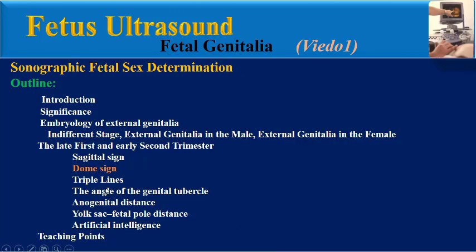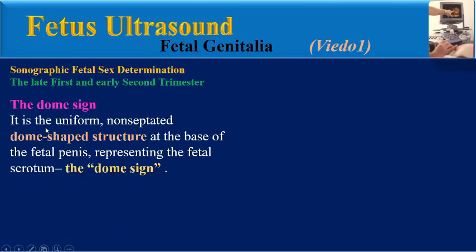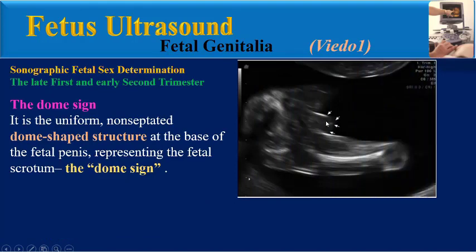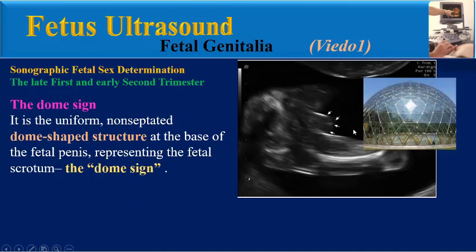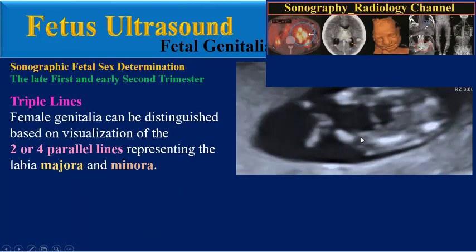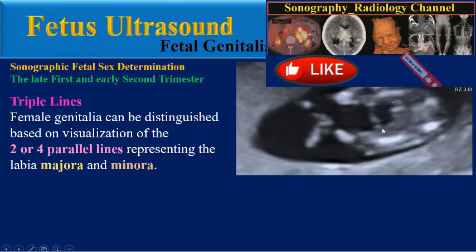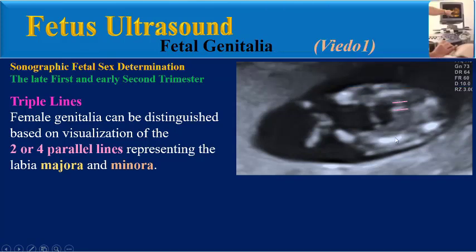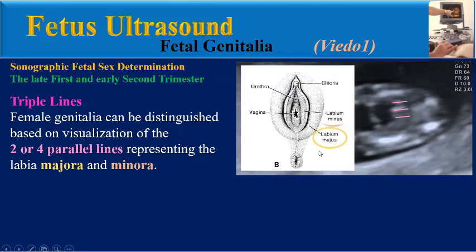The dom sign is the uniform, non-septated, dome-shaped structure at the base of the fetal penis representing the fetal scrotum, known as the dom sign. Triple lines: Female genitalia can be distinguished based on visualization of two to four parallel lines representing the labia majora and minora.